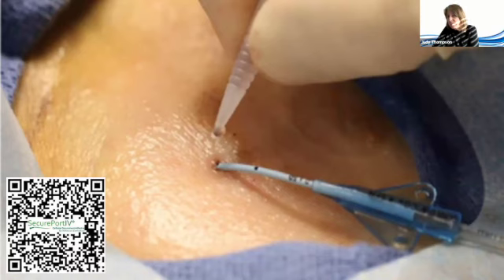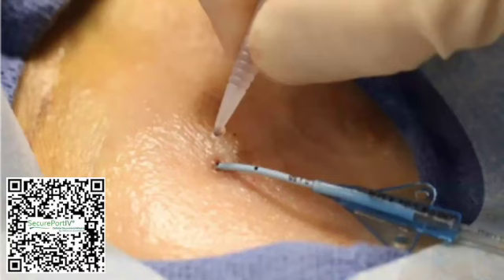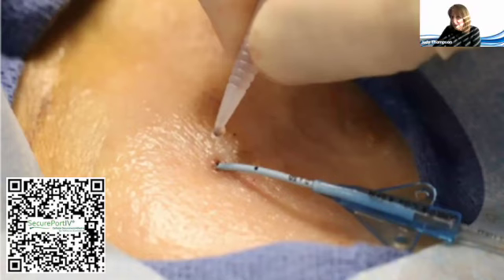What about cost comparison? Have you guys done those? I don't have the exact cost comparison. Brian might be able to chime in if you're the numbers guy with the cost. Yeah, I don't know the exact pricing of the Surgicel or QuickClot, but usually they're multiple times higher. Typically you'll see a tissue adhesive, the SecurePort IV product, being about a quarter the cost, but I don't have the exact pricing on Surgicel or QuickClot.